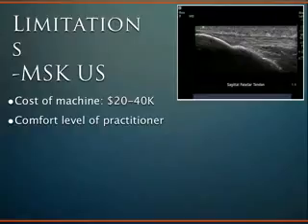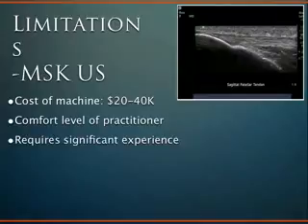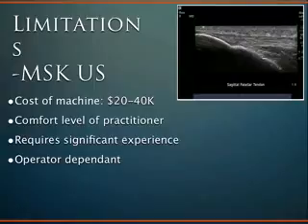Some of the other limitations, though, as I was alluding to initially, it really is practitioner dependent. So if the practitioner isn't quite in control of their anatomy knowledge or they're not quite experienced with the modality, it requires a lot of time and a lot of investment in terms of extra education. And so it is something that takes years to get comfortable with. And as I mentioned, I'm still working up to that. So it is very operator dependent.